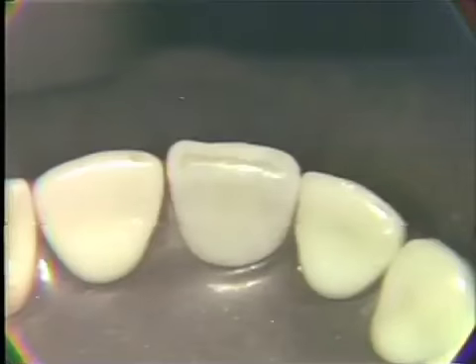We're seated in the operator's position at 11 o'clock and viewing here the mirror view of the tooth that we're going to be operating on to prepare and restore a class 3 carious lesion on the distal of tooth number 8.